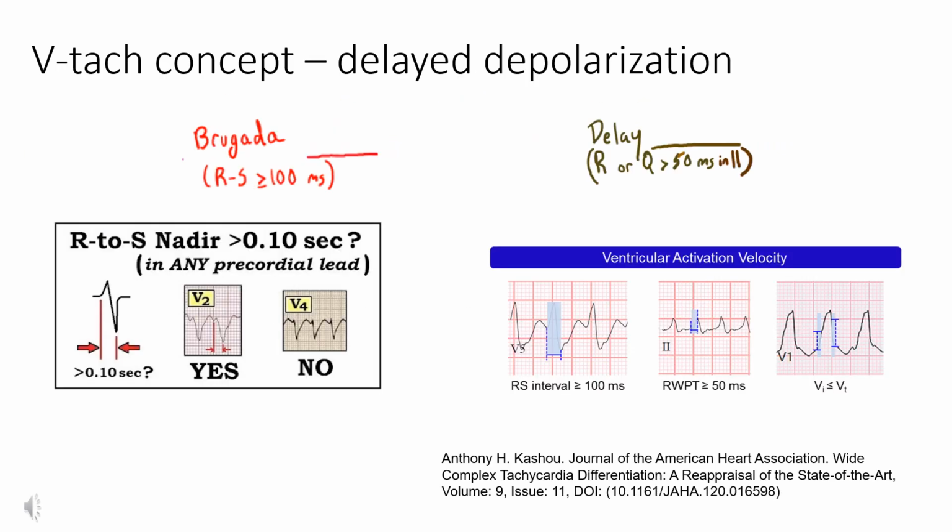The fundamental concept in identifying VTach, if there is one, I would say is delayed ventricular activation. We'll see this in 2 of the rules that we're about to go over.